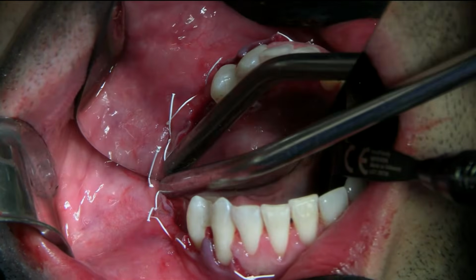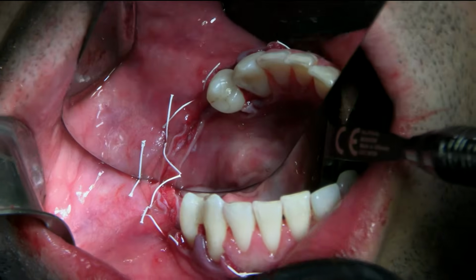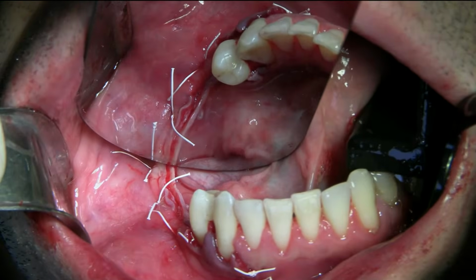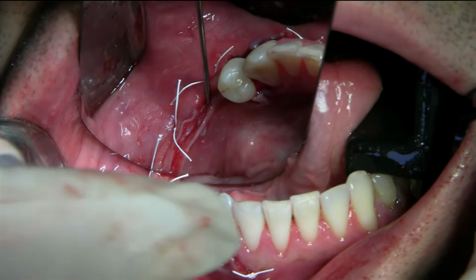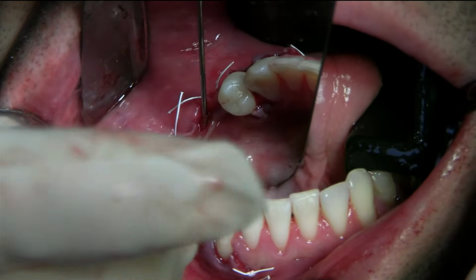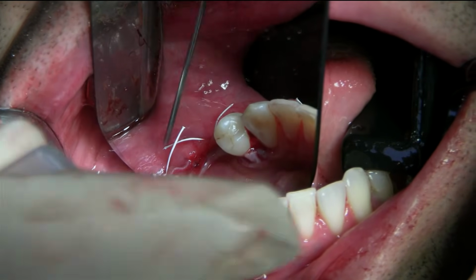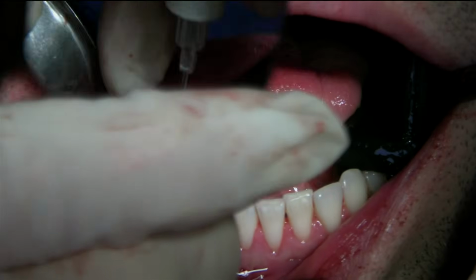But before I do that, I'll just go in with my syringe with the Emdogain and inject it. So you hold this one here, this one there. So I'm going to go in here and inject again, a bit more distal.